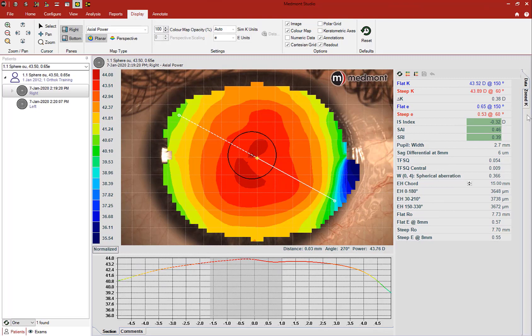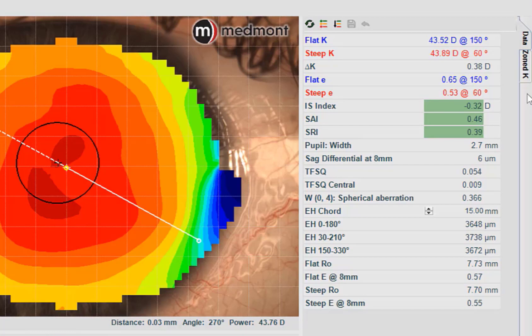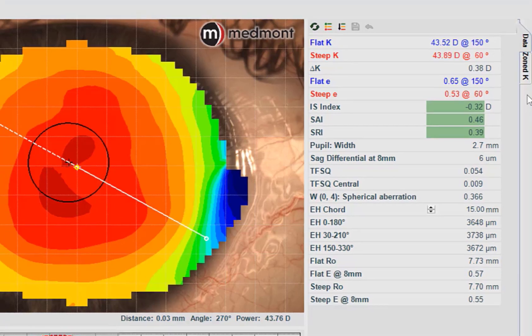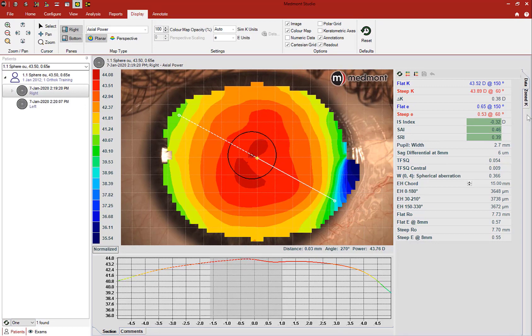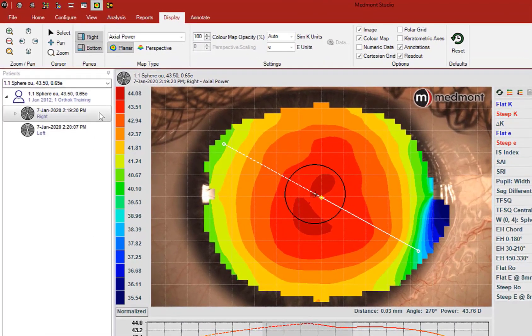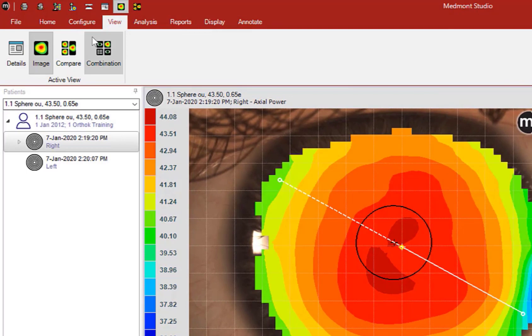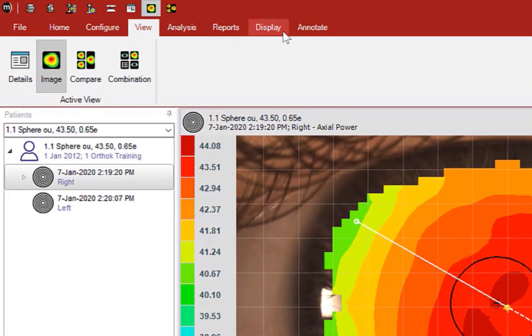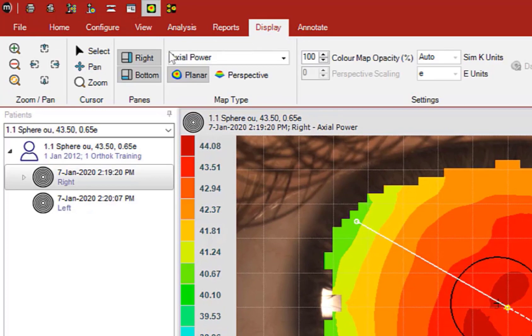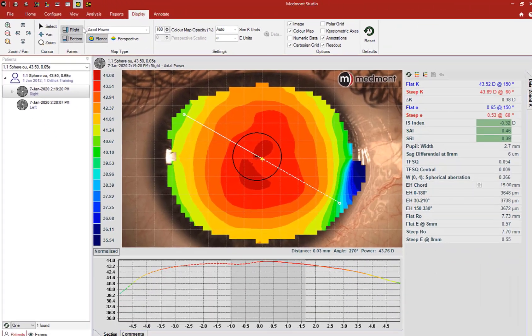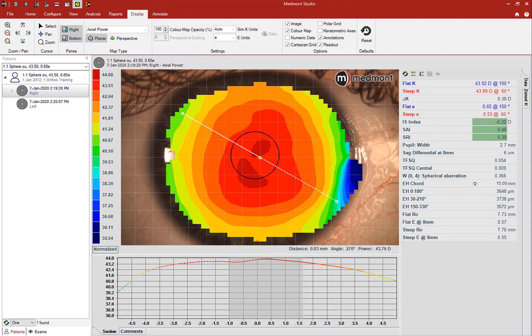Hello, and welcome to this Medmont Topographer orientation on the Attributes window. This video will attempt to uncover the Attribute Analysis Display options along with their clinical and contact lens application. My name is Randy Kojima. To display the attributes on your main Medmont window, select a map or maps, then go to View and select Image. Under Display, make sure the right is selected so the Attributes window will be visible. Let's start with the case.